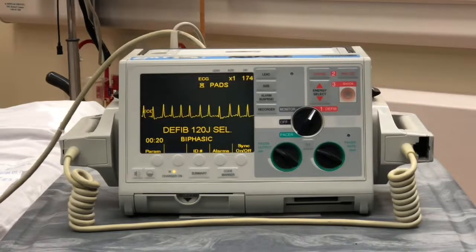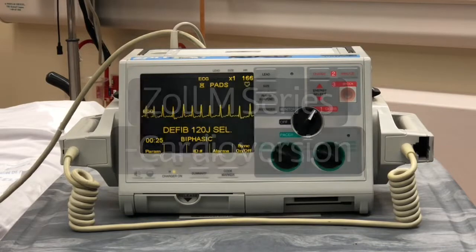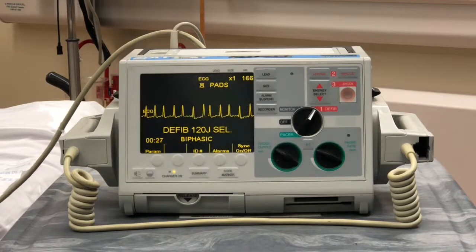Now we're going to go over the use of the Zoll M series in a cardioversion situation. Our patient here is in an unstable atrial fibrillation, and with our team at the bedside, we've done a timeout, and we've assessed that our patient is unstable and we want to deliver a cardioversion shock. For atrial fibrillation, often our energies are higher, and we are going to provide cardioversion at 120 joules.